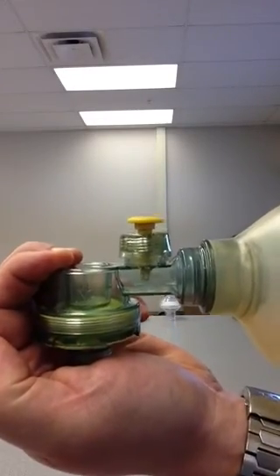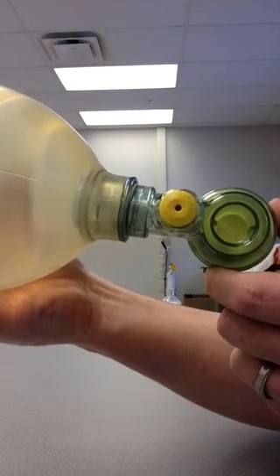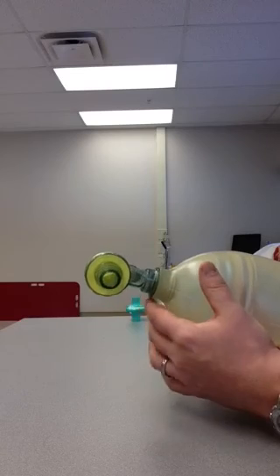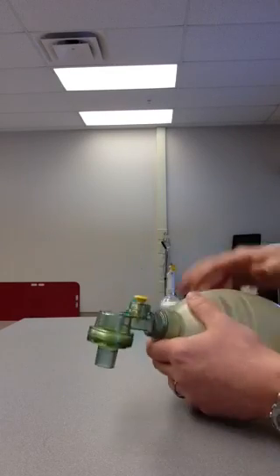So to recap the patient connection: 22mm outer diameter used with the BVM mask, and 15mm inner diameter for an intubated patient. The patient valve is in the form of a duckbill or fish mouth. We're now going to take the bag apart and reassemble it.